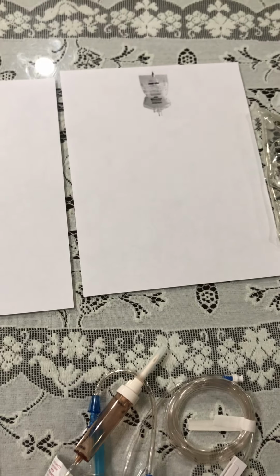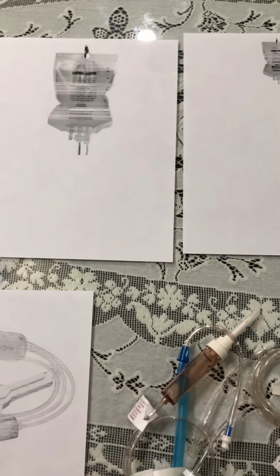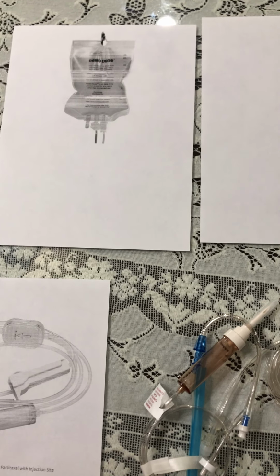My name is Brian. I am an N3 student, and today I'm going to be performing the lipid and TPN administration. Okay, so TPN is typically recommended for patients who are unable to absorb nutrients properly.